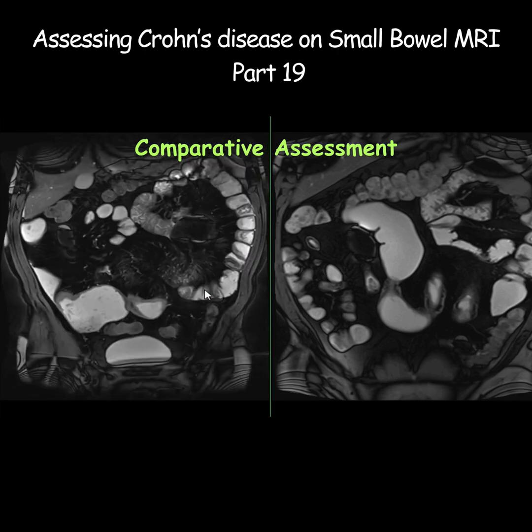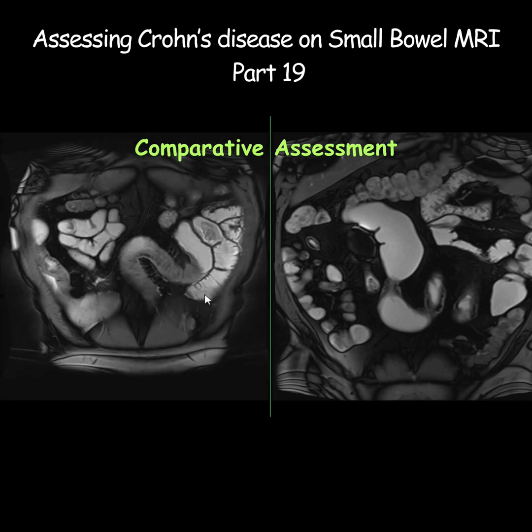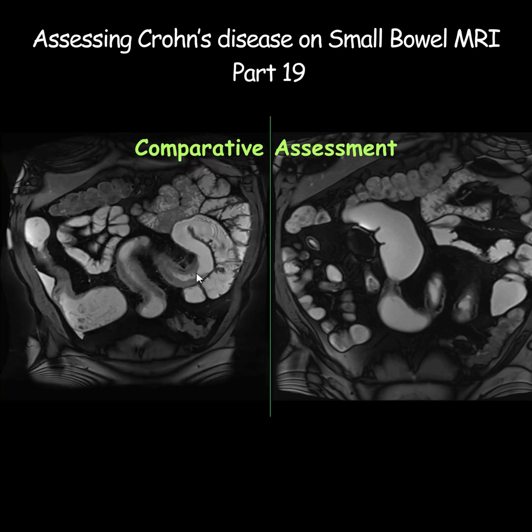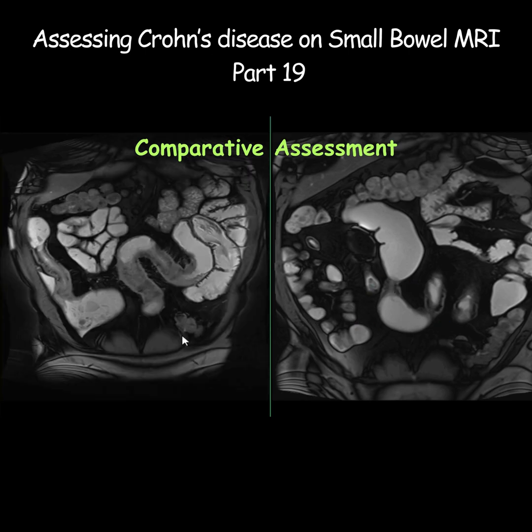All of these signs suggest superimposed active inflammation on a background of fibrous stenotic Crohn's. In these kind of studies, we would like to provide the comparison in wall thickening between the two studies and also compare each and every segment in terms of their length and the degree of active inflammation.